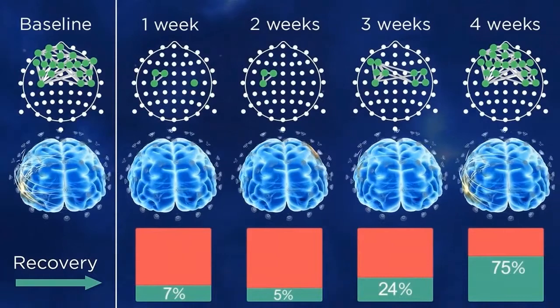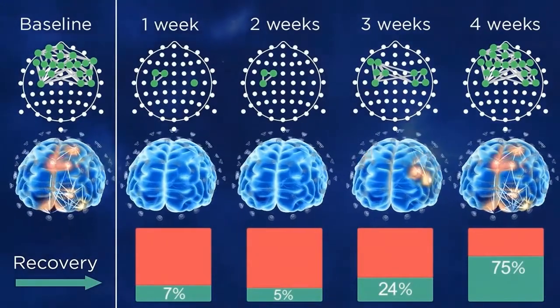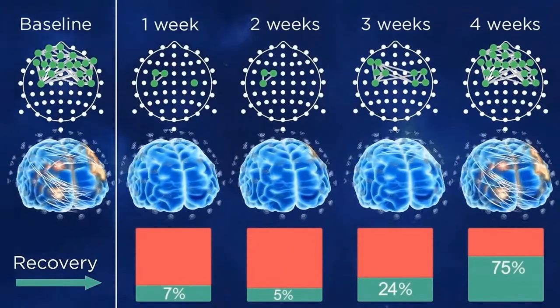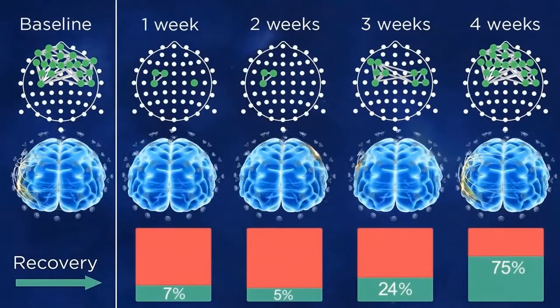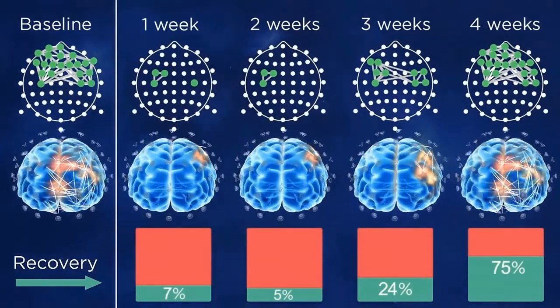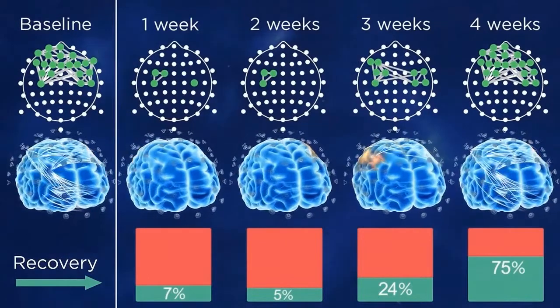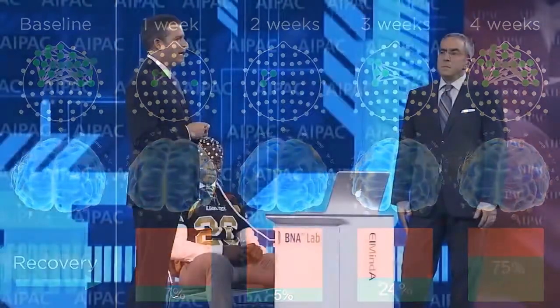And on the right side, you can see post-concussion what happens. You don't have to be a doctor to see that there is a significant change from his baseline to first week after concussion. It took this kid at least 4 weeks for his brain to fully recover. But unfortunately, without objective tools to monitor the brain, this kid got back to play before 3 weeks. And as you read on the news, this is risk of cognitive brain damage, especially if he gets another hit in the head. So thank you very much.